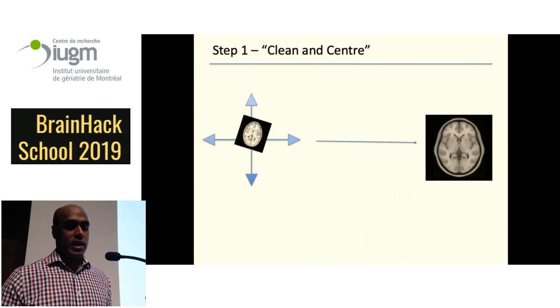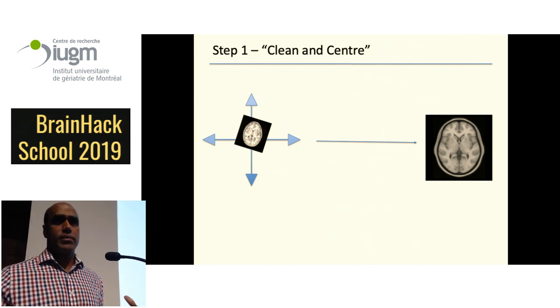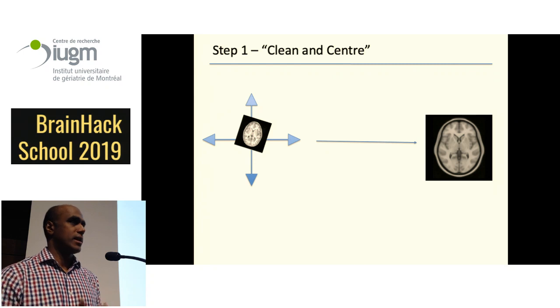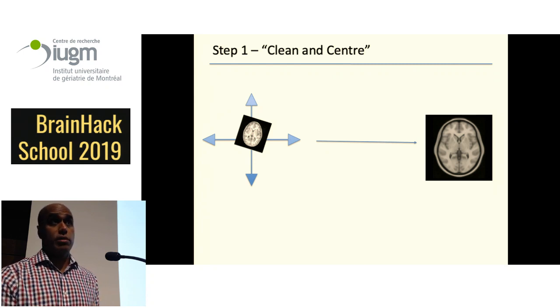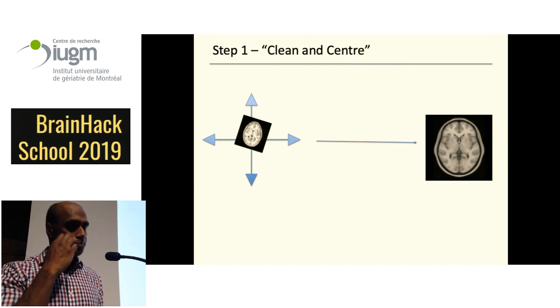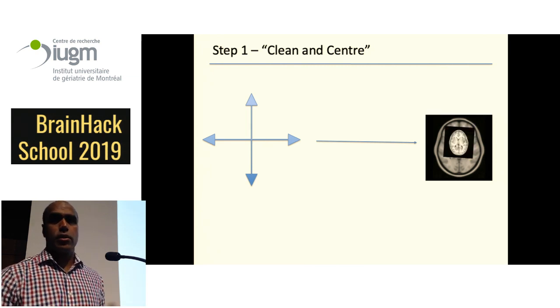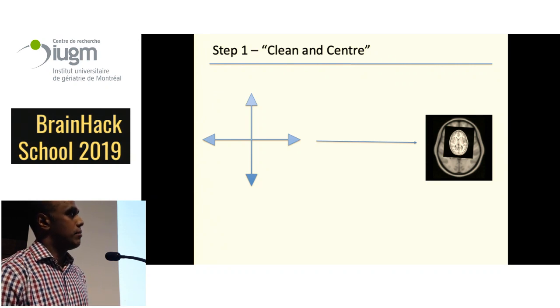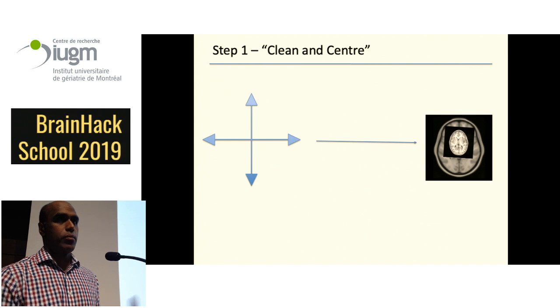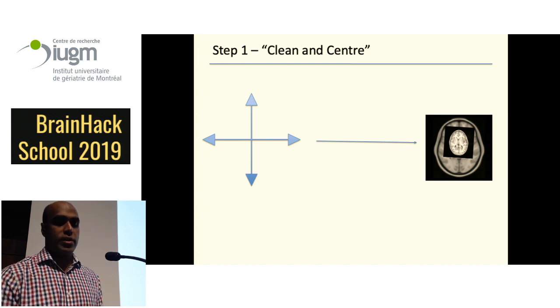So the first one is, when an image comes out of the scanner, it comes out in its own native coordinate space. That might be very far from something like MNI space, which a lot of us rely upon in order to align our data regardless of the analysis that we do, right? And so this could even be a pre-processing pipeline for your structural images, with the ultimate goal of aligning your functional images, for example, or your diffusion images. And so it has this native coordinate space, and all we do is we force the center to be the middle of the image, and what you get is some nice fake overlap between the original image and MNI space. And we can store that transformation as well, so that if you ever want to go back to the complete native space of your image, you can have that transform again.